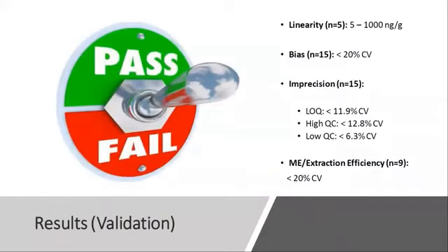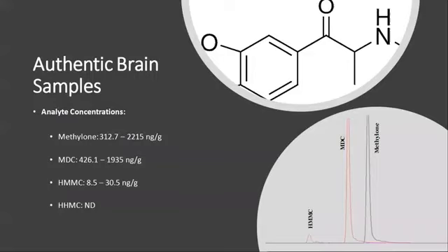The results for method validation were evaluated by following parameters established by the Scientific Working Group for Forensic Toxicology. In the method validation, we tested for calibration, bias, imprecision, matrix effect, extraction, and process efficiency. So most parameters presented a coefficient of variation within 20% according to the guidelines for method validation, which makes this method reliable in terms of sustainability. In addition to that, all experiments for validation were performed using quality controls to preserve the integrity of the method.